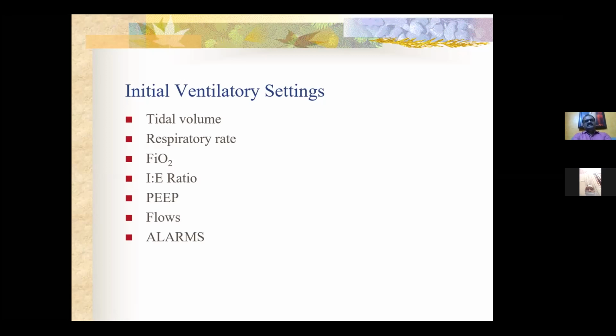Okay. So always keep in mind that the patient was breathing at around 30 or 40, maybe sometimes more. And no ventilator setting is complete without setting the alarms. So we'll go step by step, how we are going to do it.